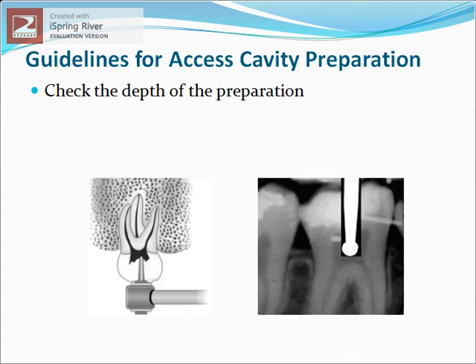Guidelines for access cavity preparation. Before starting the access cavity preparation, we can check the depth of the preparation, and this can be simply done by aligning the burr and the handpiece against the preoperative radiograph.